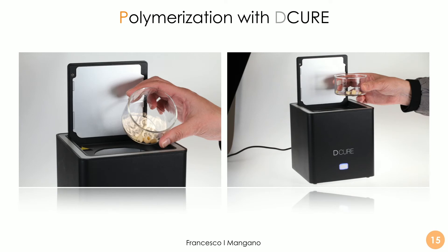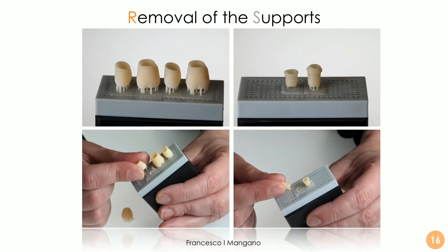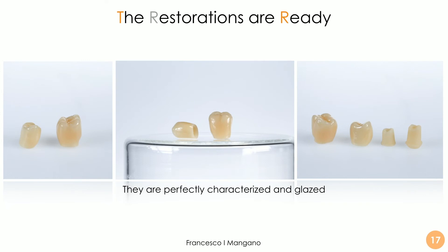We removed the restorations from their supports and placed them into the DCURE. Here are the restorations before being removed from the supports — the easy removal is granted by the technology implemented by the DFAB and DWS. Obviously we can characterize, we can glaze, we can polish more or less. The ability of the dental technician is still key, but with the photo shade technology we have three levels of color, which is very important to replicate what is seen in the patient's mouth. After characterization and glazing, these hybrid resin-ceramic crowns look perfect and are ready for clinical application — both the crowns and the individual hybrid abutments.